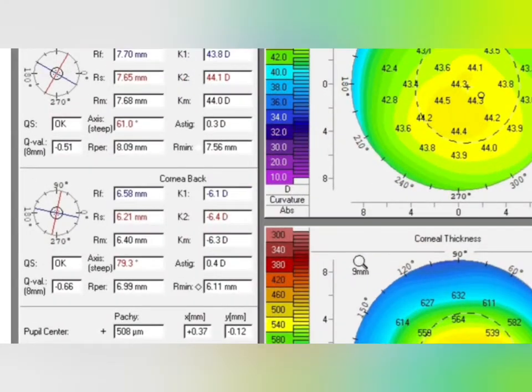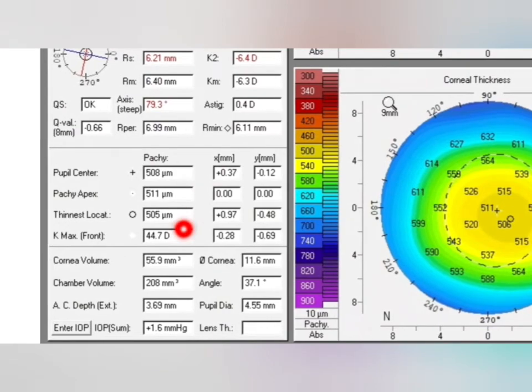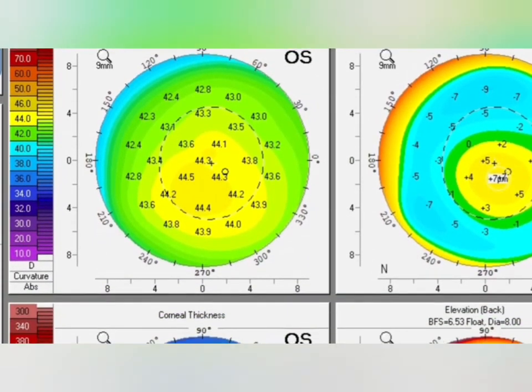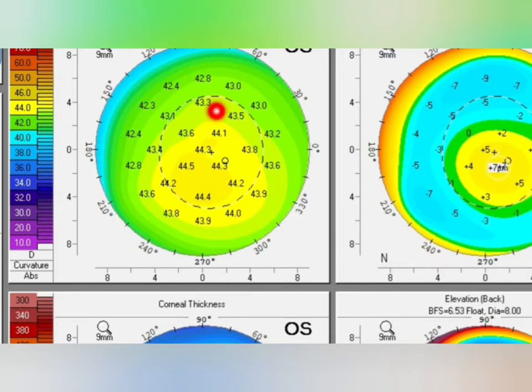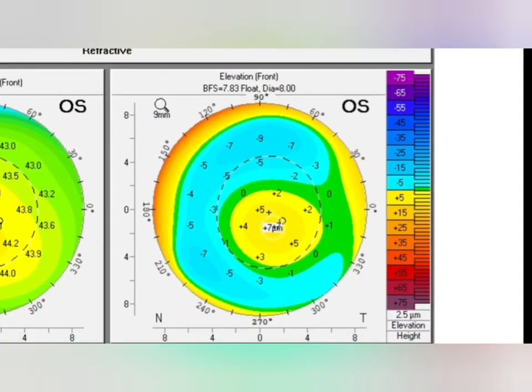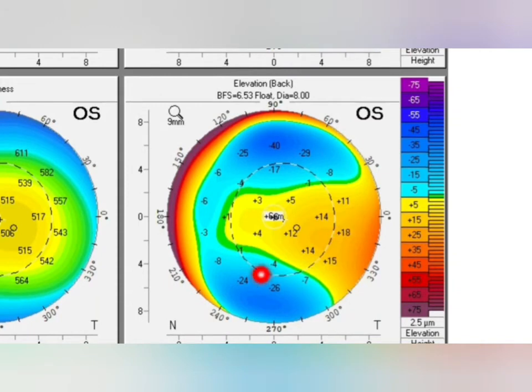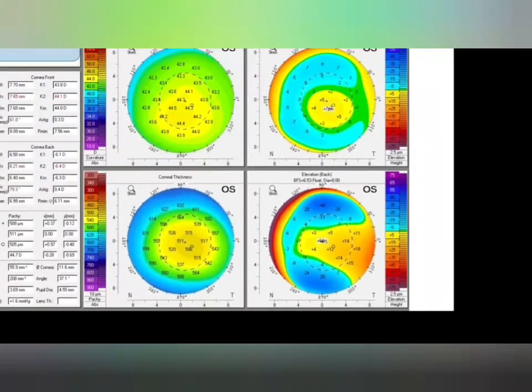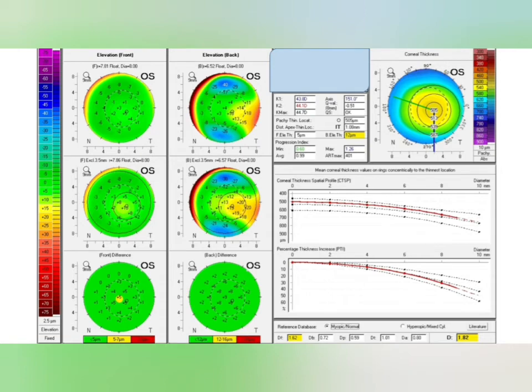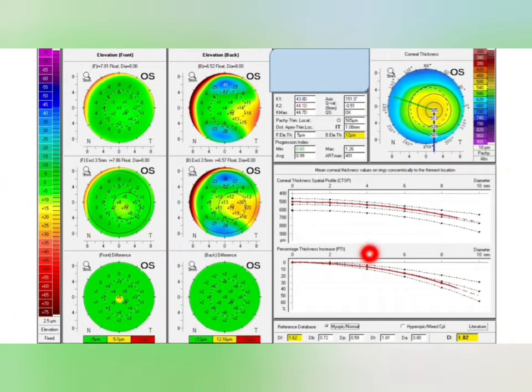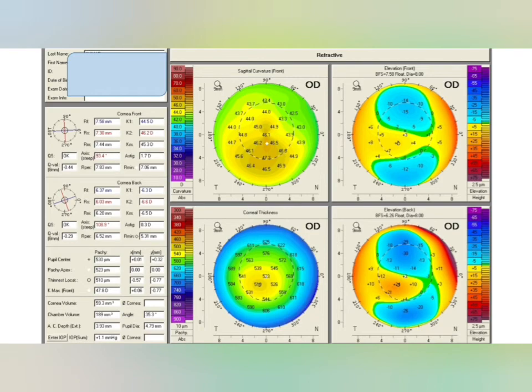Next case: QS value is OK, Q value normal. Kmx value is less than 47.20 and thinnest local is 505 — both normal. In the anterior sagittal map there is inferior steepening, but the difference is not more than 2.5 — normal. In elevation front the value is plus 5 — less than plus 8. In elevation back it is plus 18 — less than plus 20. The thinnest point is 506, thickness in normal range. In the Belin-Ambrósio map the average value is 0.99, less than 1.2, and the red curve is continuous up to 6mm — absolutely normal cornea.